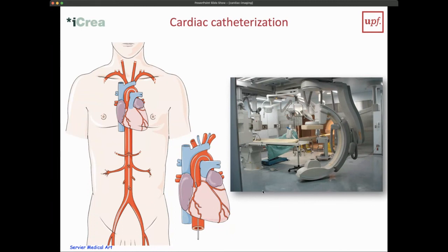because as I said, the coronary arteries are actually relatively small. When we look at them, it would be a few millimeters, say about 3-4 millimeters. That would be the diameter of the origin of the coronary arteries in an adult. But very quickly after splitting, it actually goes sub-millimeter. So what we will see is that the interesting arteries are in the order of size of 1 millimeter, 0.5 millimeter in diameter. And these are clinically relevant.